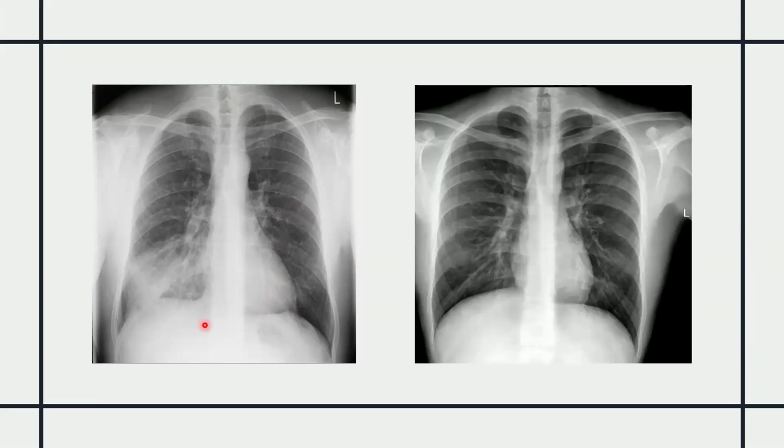X-ray is very important in the diagnosis of pneumonia. So you should be expert in picking up the findings which point to pneumonia. In this X-ray, you can see that there is an opacification in the right lower zone. You compare it on the other side, there is no opacification. This is the same X-ray which we have already discussed. And when we compare it with the normal X-ray, which you should always do, then again it confirms that this opacification is abnormal. So this is right lower zone consolidation.